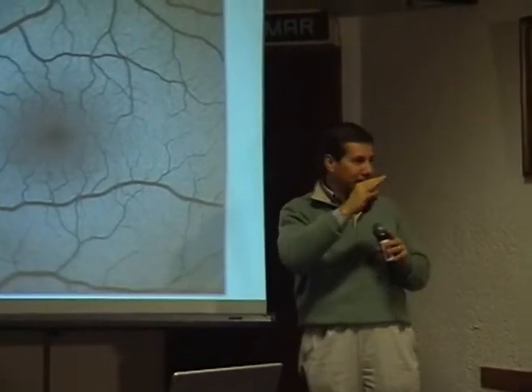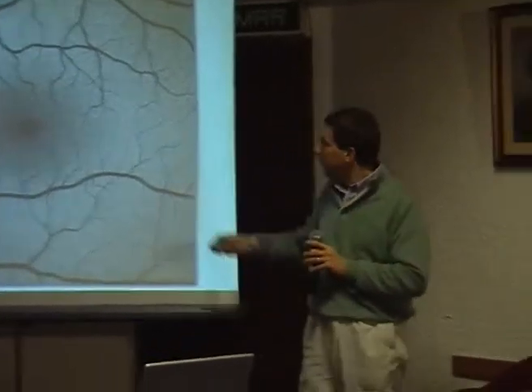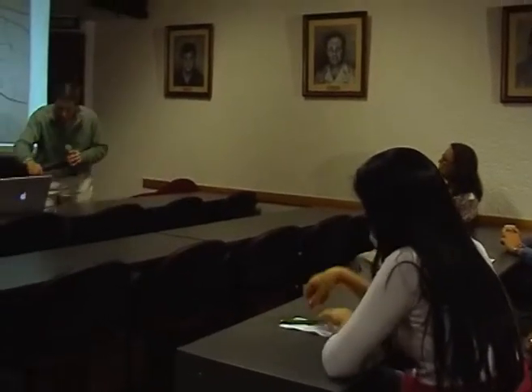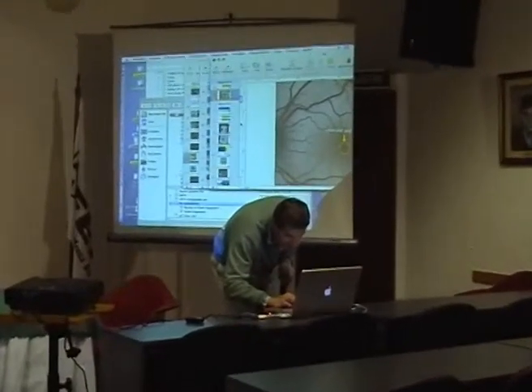There are some theories about the anatomy. That is female? With a male. Yes, I think I have some examples. I will show you the difference. Let me see if I can catch it immediately.